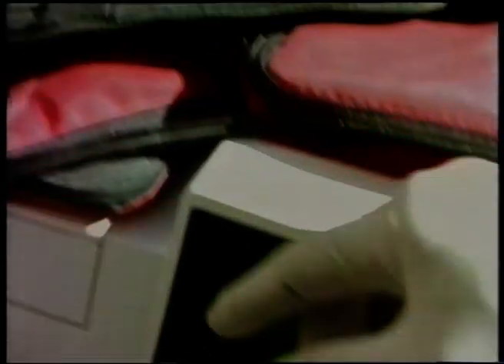At the end of the code, the EMT pushed the Summary button to obtain a summary of resuscitation events. This feature is valuable for passing along information to advanced life support and emergency department personnel. This is an overview of what it takes to operate the LIFEPAK 300 defibrillator in a code situation.